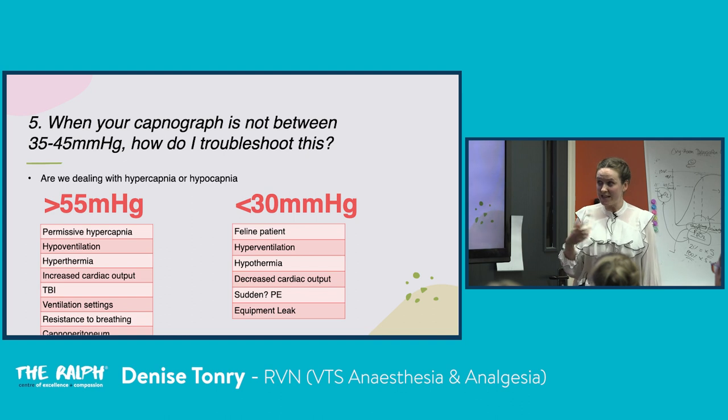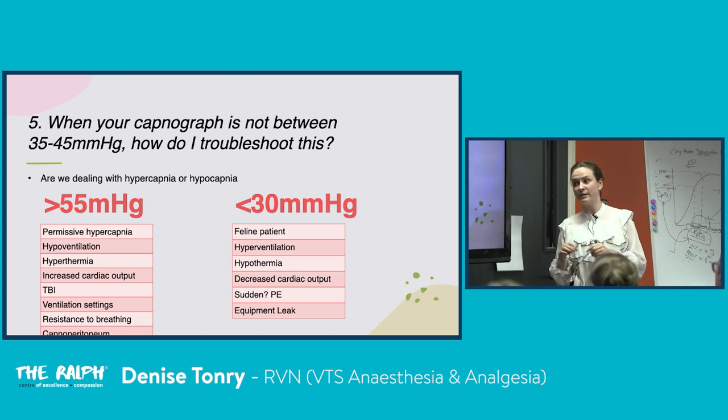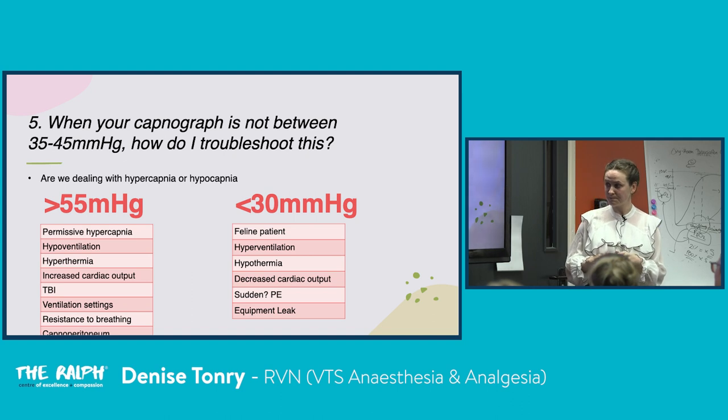So it depends what you have available to you when you anaesthetize them, but don't panic if the first capnograph reading you get is 55. You're like, this is the breed. And you can by all means provide IPPV, but these are another type of patient that love for you to breathe for them. So they tend to give over very quickly and then you get stuck.